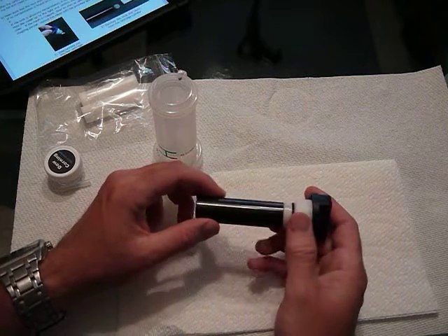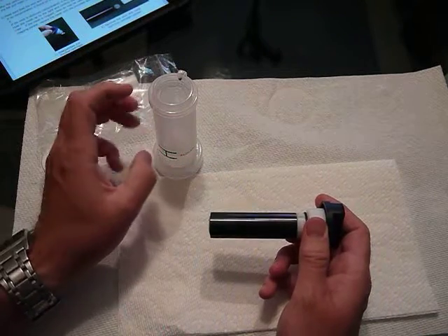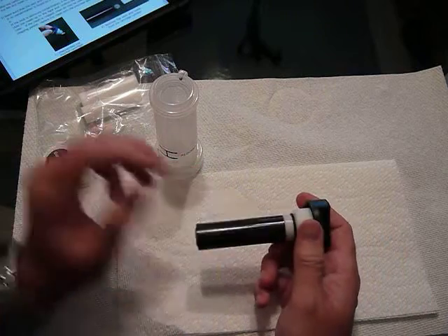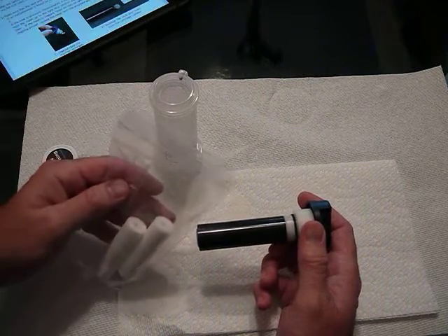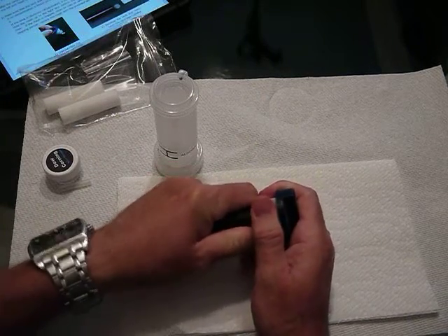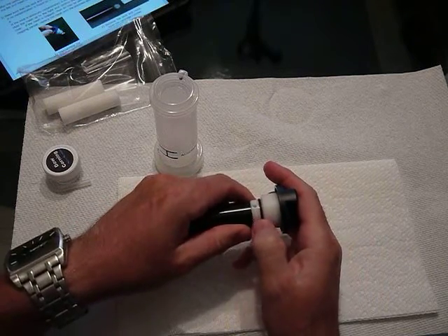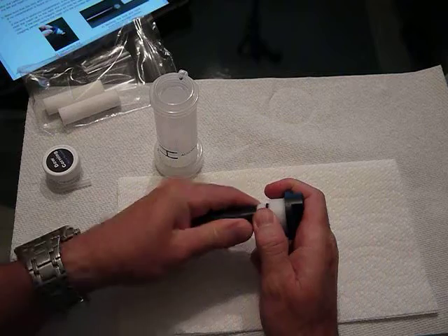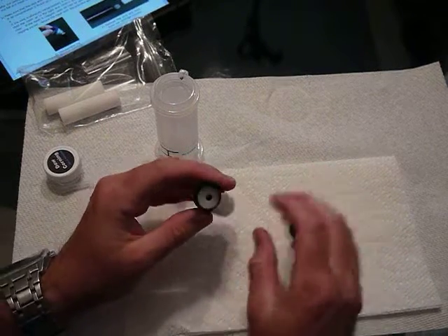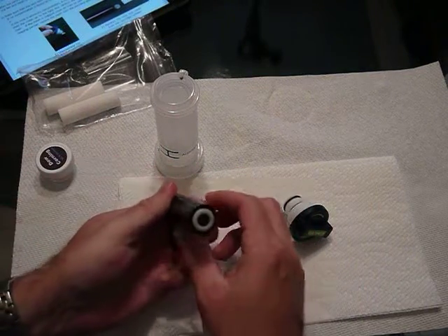So inside here, this is the alcohol cartridge itself. If you have the weaker alcohol soaked up inside here, then you may want to replace the felt and the mesh as well. So I'll show you how to take this apart. I'm just wiggling this back and forth, and you can see there's an O-ring here that seals to the machine, but another O-ring will become evident here. So we've got two O-rings, and then we've got the felt inside that soaks up the alcohol, and on the end we have a mesh.